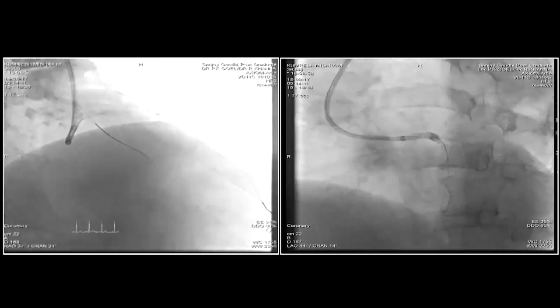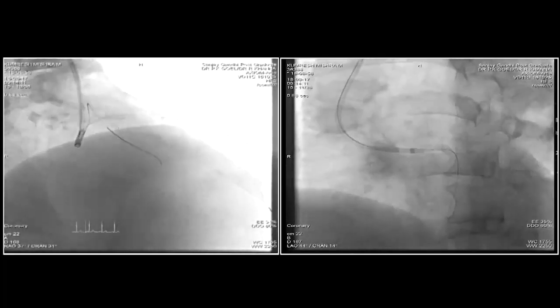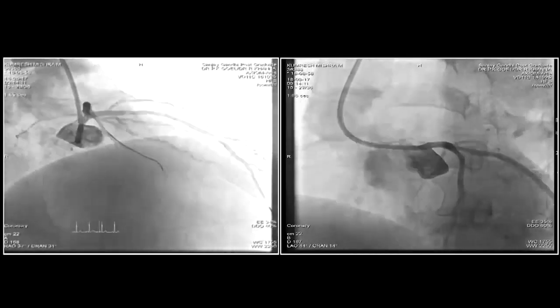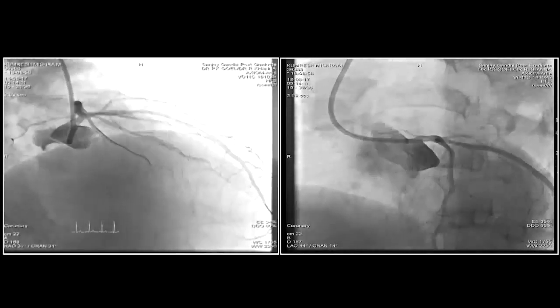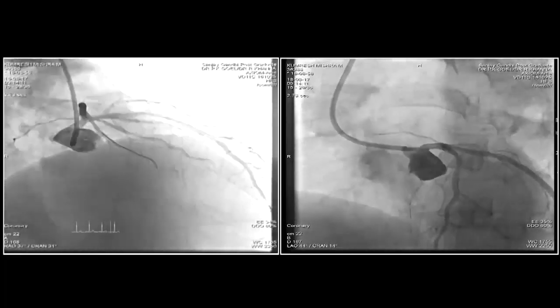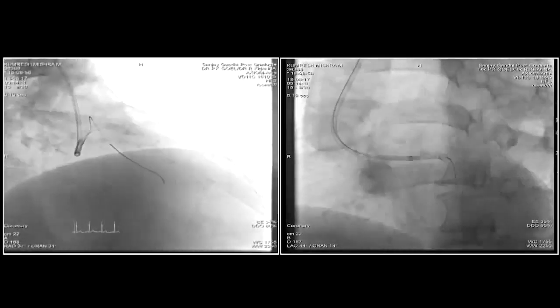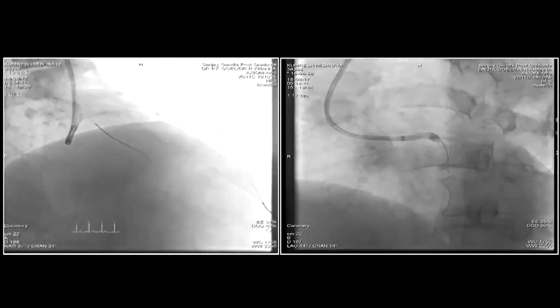Are we going to NC POT now, sir? I'll do some proximal POT to the left main with a 4.0 NC first. Okay? And then I'll do an IVUS, because if the circumflex is open, now the issue is whether I should dilate the side branch stent hole towards the circumflex or not. What does Dr. Sushil Kundali say about it?